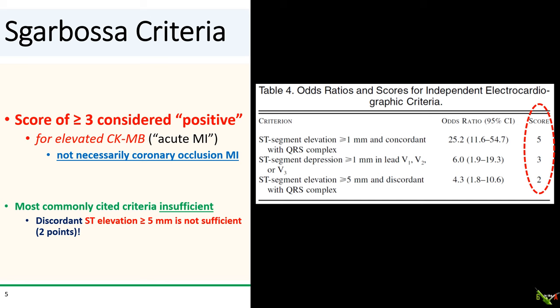You get five points for the first criterion, three points for the second, and two points for the last and most frequently cited criterion. You need a total of three points to be considered positive by Sgarbossa. And the most commonly cited criterion — five millimeters or more of discordant ST elevation — is not sufficient. It only gets two points.